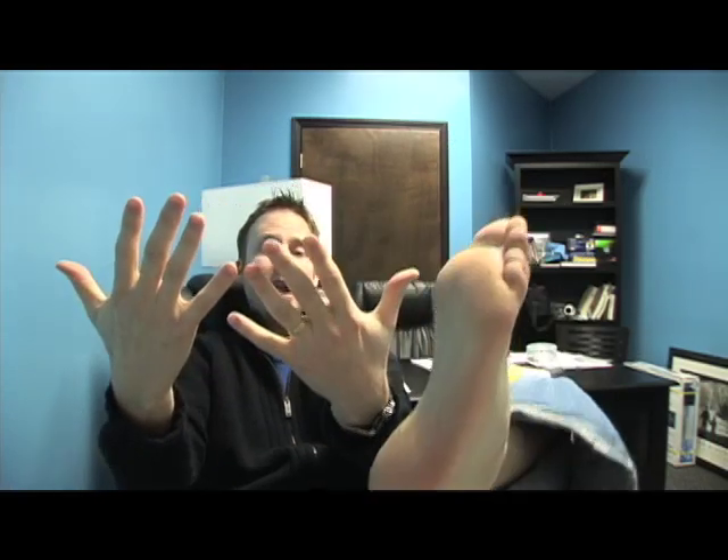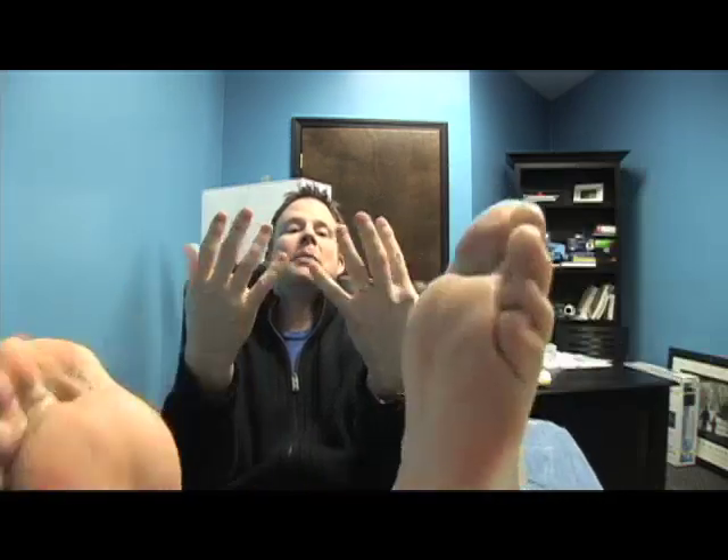I check my blood sugar about 16 times a day, and here is why. I have to check it when I wake up and when I go to bed — that's two. Before and after every meal — that's another six. My meter reminds me every hour and a half to check again — another seven. And if I've exercised that day I need to check it before, after, and during exercise.